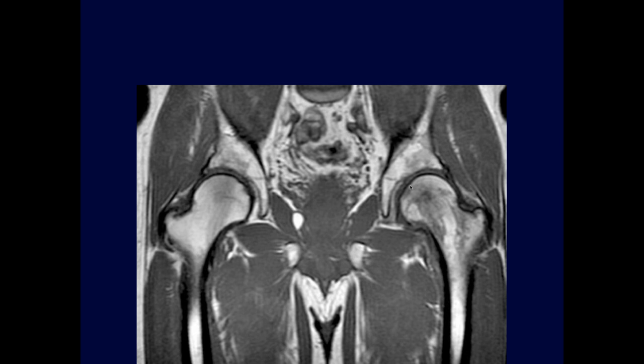Talking about right in here? Yeah, and there's also a little irregularity over here. But this is a little different than the last one, and this is an important difference: the immediate subchondral bone, except for over here near the fovea, on the primary weight-bearing surface up here, the subchondral bone is relatively normal in signal, though it is a little bit different from the other side.